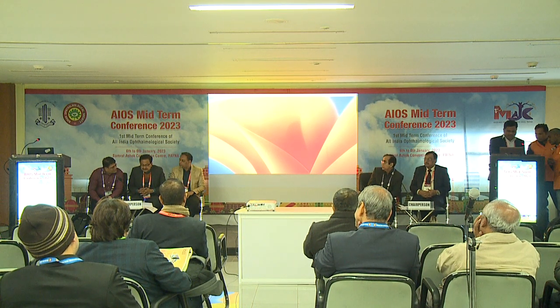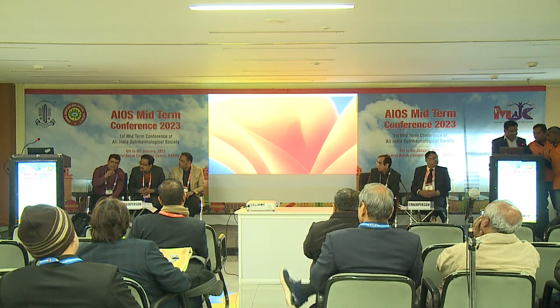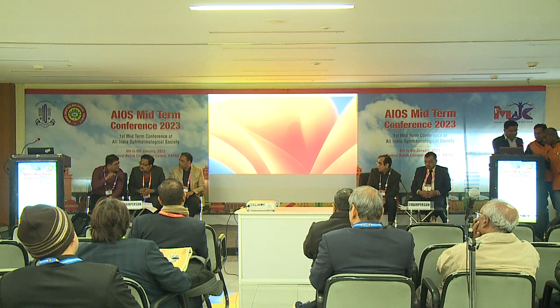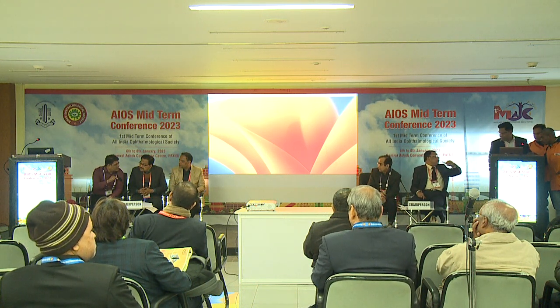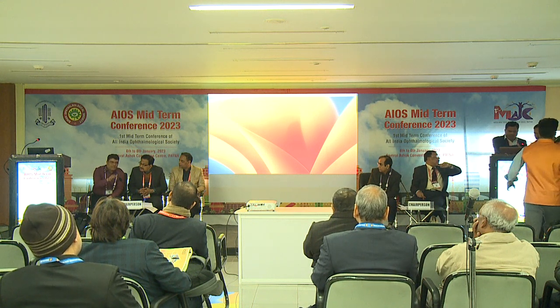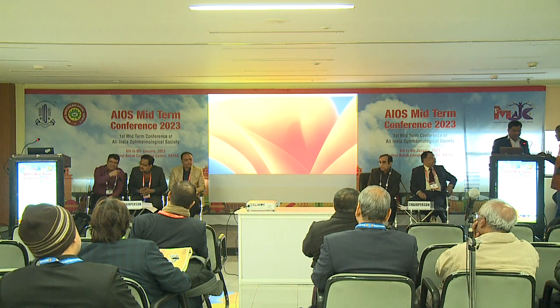Another trick is that I have an Alcon machine, no financial interest. It has a radio frequency capsulotomy probe. In cases like microspherophakia and subluxation, where it's difficult to puncture, I just go ahead with that and it gives a puncture. Once you have a puncture, you can cut with micro scissors and enlarge it.